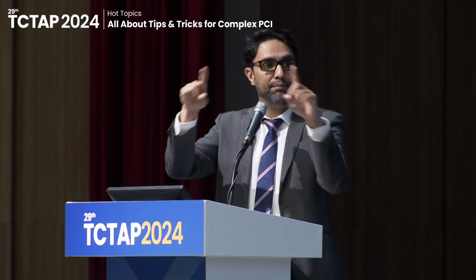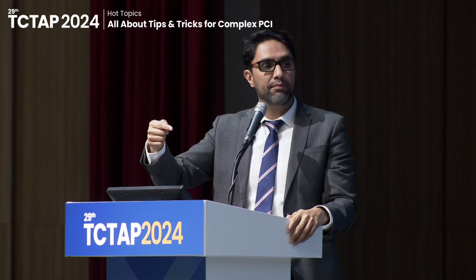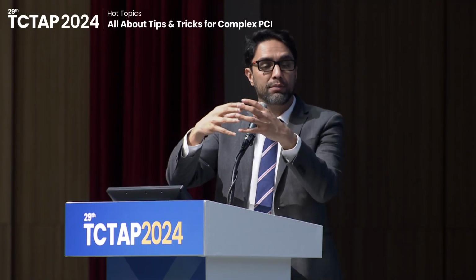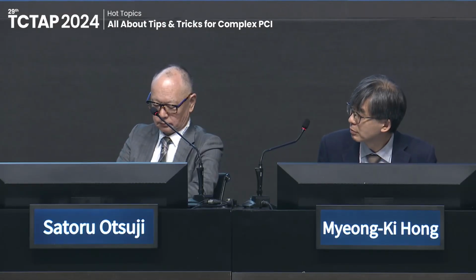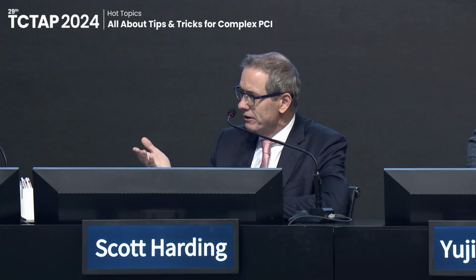So it looks just like a plate. You need the non-compliant balloon subsequently with high pressure to break the plate into pieces. While we've got you there, I think one of the important things you might want to comment on is de-airing the balloon. I mean, that's a major thing. And I think you've learned a lot.